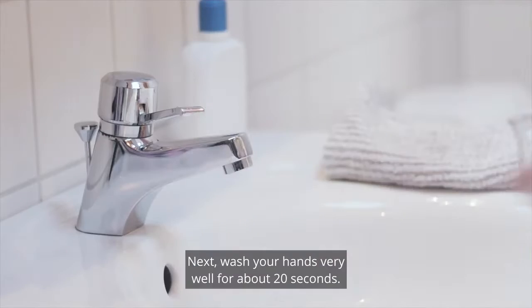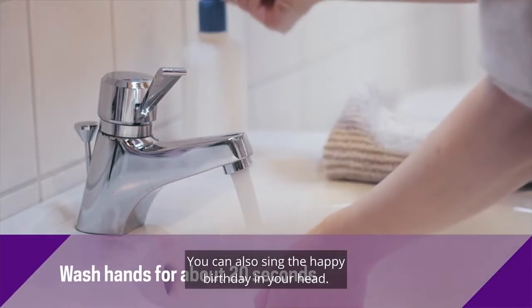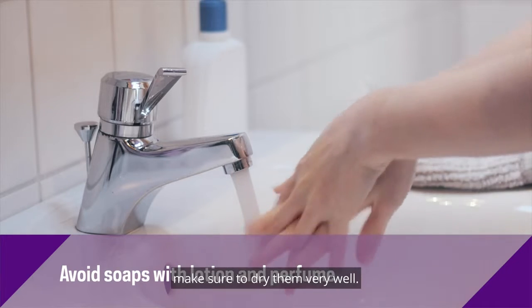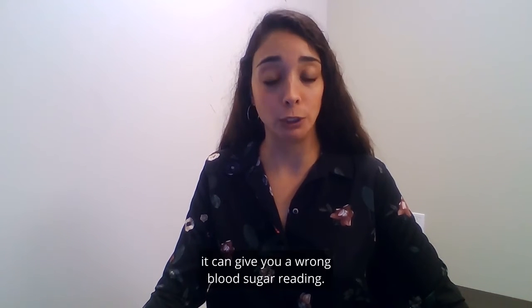First make sure all of these are in one place so we can get ready to test our blood sugar. Next wash your hands very well for about 20 seconds — you can also sing Happy Birthday in your head. Avoid soaps that have a lot of lotion or perfume, and after you wash your hands make sure to dry them very well. If your hands have lotion or are wet it can give you a wrong blood sugar reading.